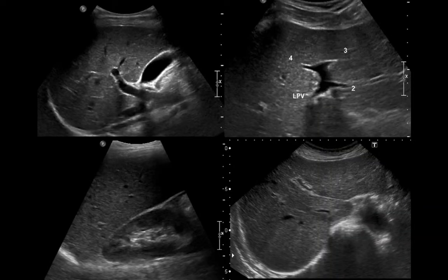This is the hepatobiliary system. When you put the probe transverse just at the upper part of the subxiphoid area, you will see this eye shape. This is our left branch, different from the hepatic vein. Hepatic vein, the outer is darker, not lightening.